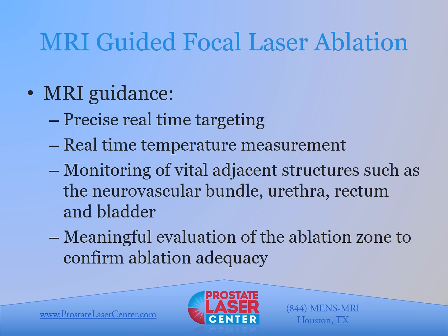In addition, it allows one to monitor vital adjacent structures such as the neurovascular bundle, urethra, rectum, and bladder, which further increases safety. And then when the ablation is over, we do a post-contrast MRI. What that allows us to see is the zone of ablation that we actually created, not the one that's based off of temperature maps or our experience. We actually see, did we kill the area of tissue that we thought we killed? That real-time feedback is tremendously helpful.